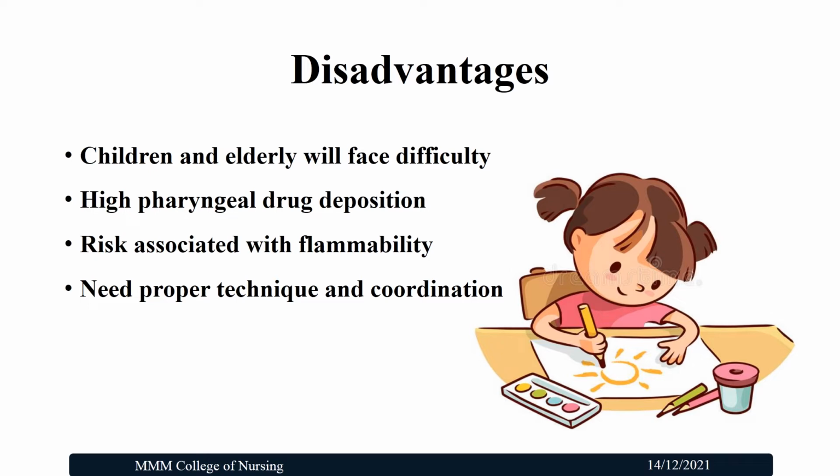It also has a few disadvantages. Children and elderly people may find difficulty in using this because it needs proper usage technique and coordination, and it can cause high pharyngeal drug deposition, and it also has the risk associated with flammability.